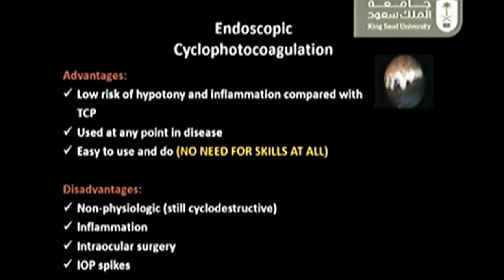So the advantages of ECP: low risk of hypotony and inflammation compared with transscleral diode laser cyclophotocoagulation. It can be used at any point in the disease, and it's easy to do, so it doesn't need special skills. If you are an anterior segment surgeon, you can do it. You can do it in aphakic and pseudophakic eyes. I came across one report, but I haven't done it before, so I'm not sure if you can injure the lens or not. It's very easy to perform, and it can give good results in certain selected cases.